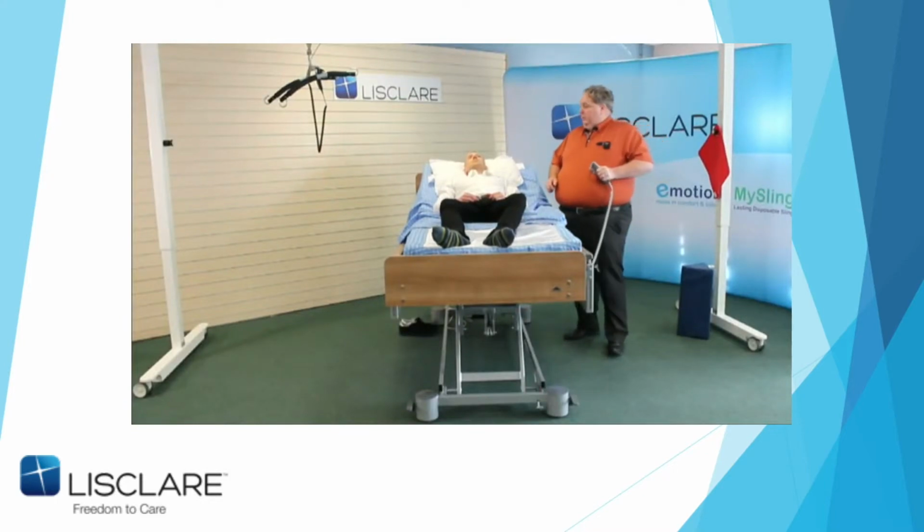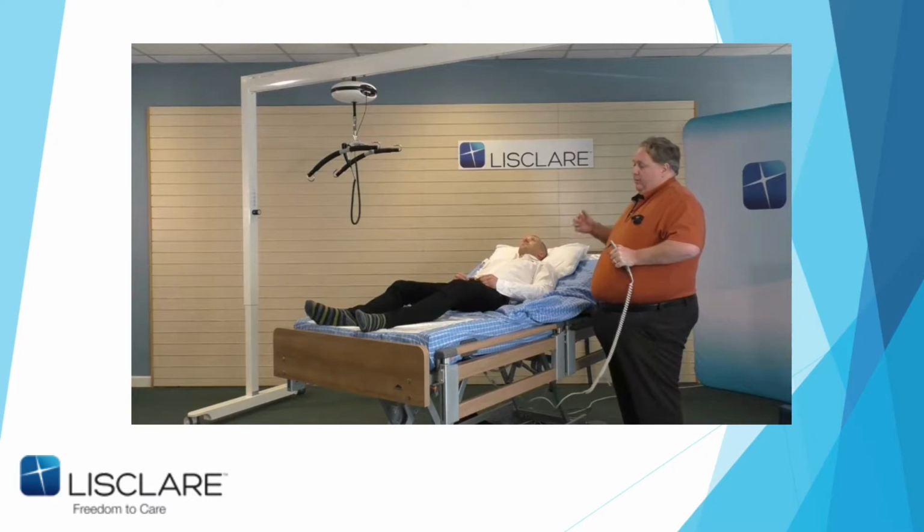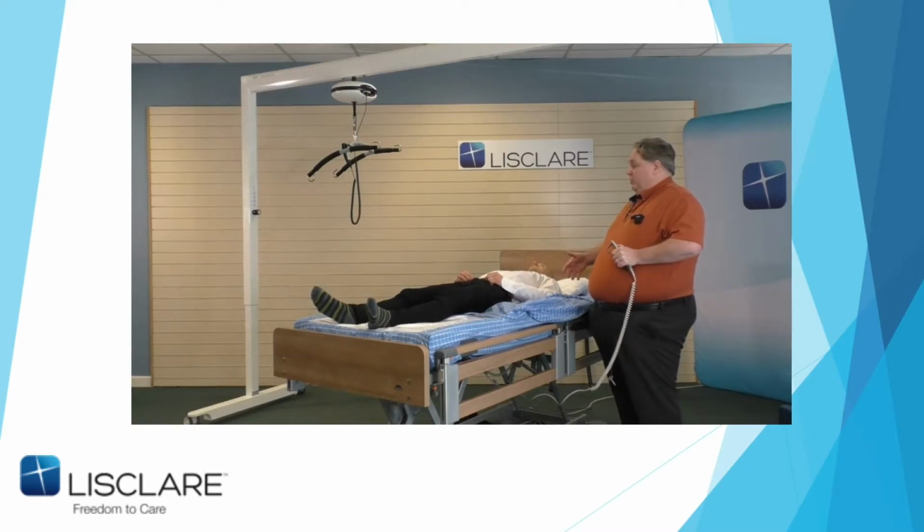Okay, he should end up where he started in the first place. Now, there's a lot of training going on with single care providers, and I respect that. My attitude about that was there's always been a single care provider, and it's usually a family member. And that's the people that John and myself are trained to show up and how to use this correctly.